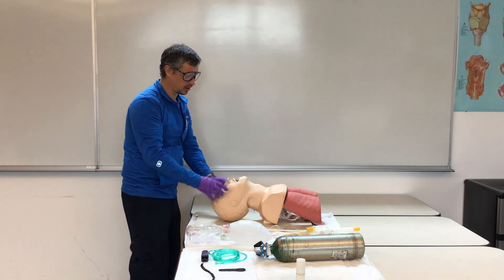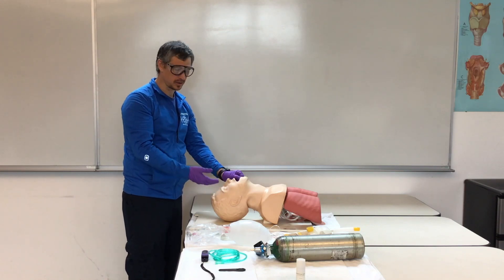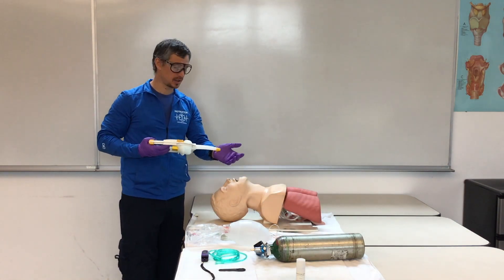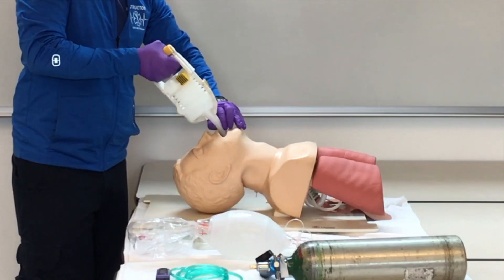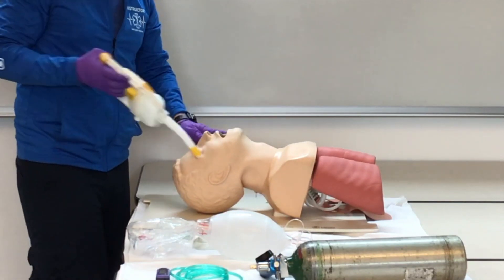We're going to look in the patient's mouth to see if they have any vomitus or secretions. If we see vomitus, we're going to take our suction — just like in our suction station. Check our suction, measure, insert, and apply suction in a sweeping motion no longer than 10 seconds.